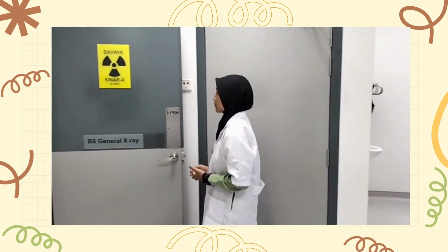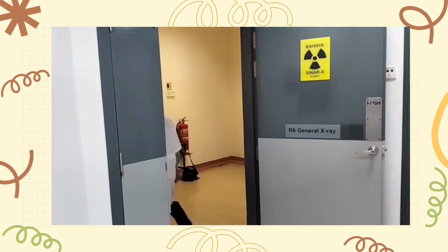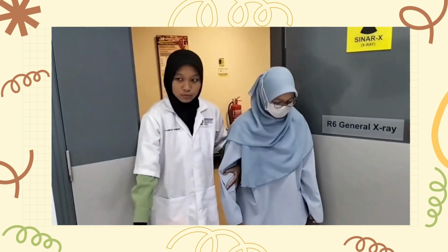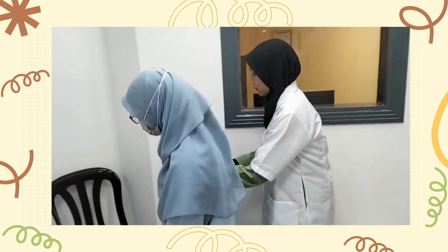So next, we're going to call the patient. Miss Sakina binti Muhammad Faiz. Yes. Okay. So please sit there first. Okay, now I confirm your name. Is your name Sakina binti Muhammad Faiz? Yes. May you say your ID number?